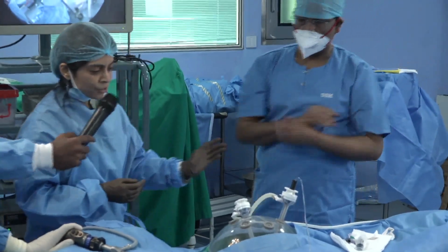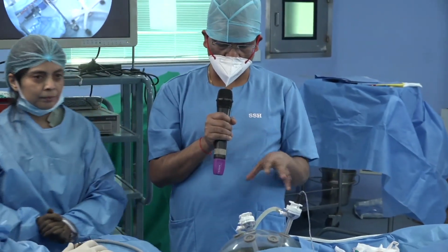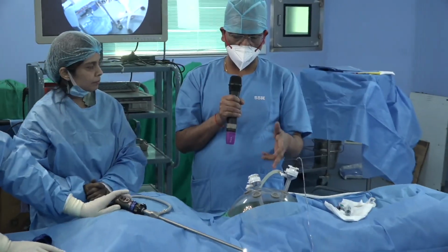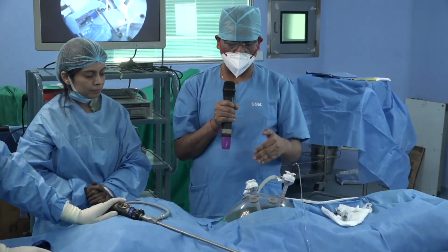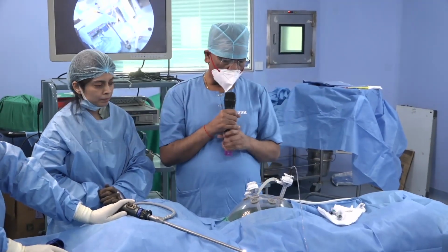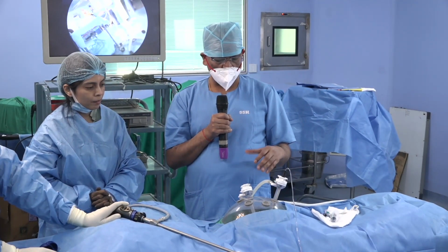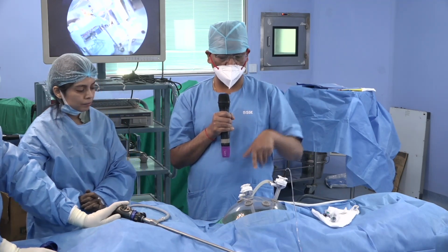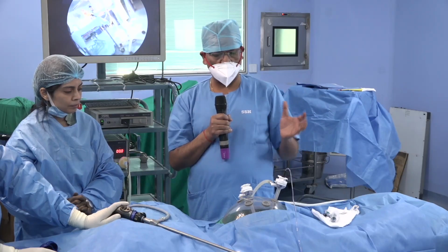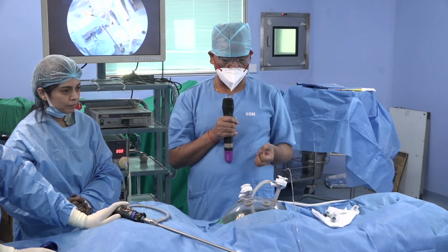Dr. Ray wants to say something. Regarding the port placement, that is very important in case of PIPAC, because normally the first port is around the umbilicus, 1 centimeter to the right side of the umbilicus, where the falciform ligament is attached, on the right side, only for the telescope. And for another port, usually, even with metastatic disease, the left subcostal area, 2 finger breadths below, that area is usually free in 90 to 95% of cases, so you can put the second port there.